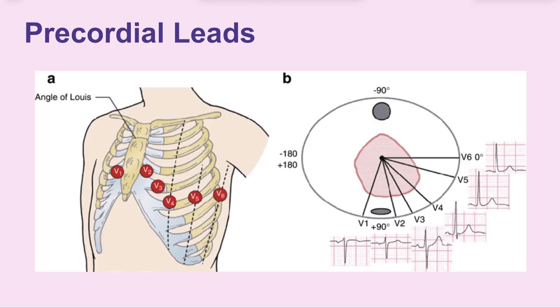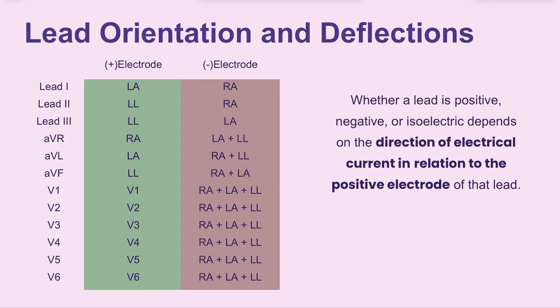And these, again, are in the transverse plane of the heart. So instead of looking at a heart as we will often see it in the anatomical position, we're going to think that we are slicing through the side of it. We're taking a cross section of the heart, and we're looking at it at those different angles.